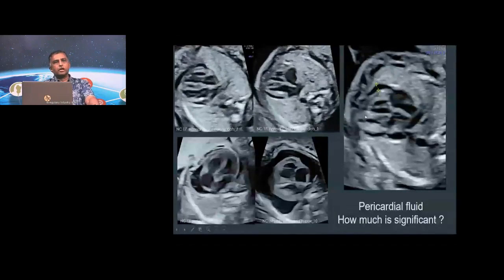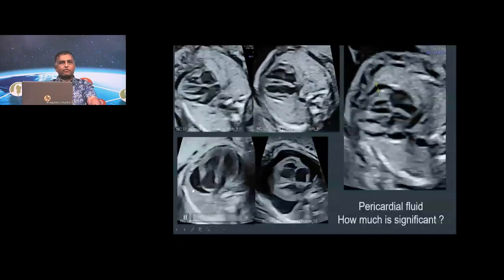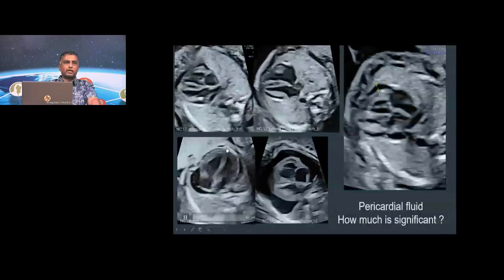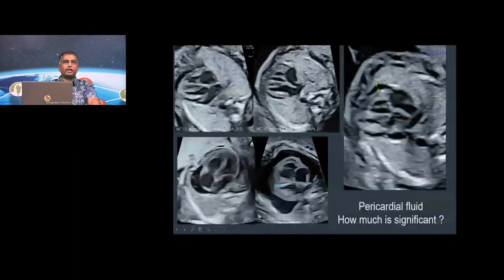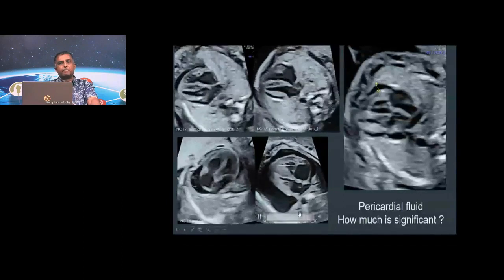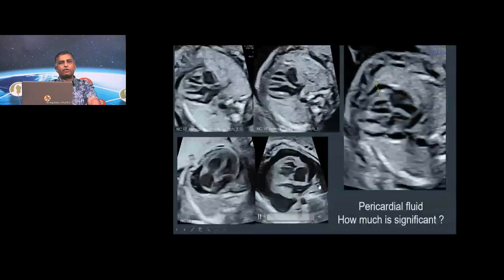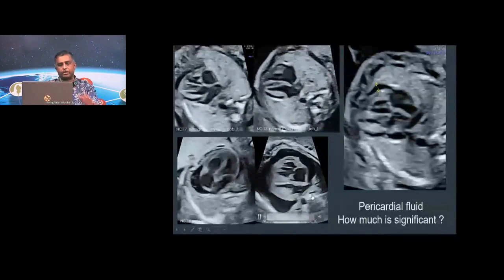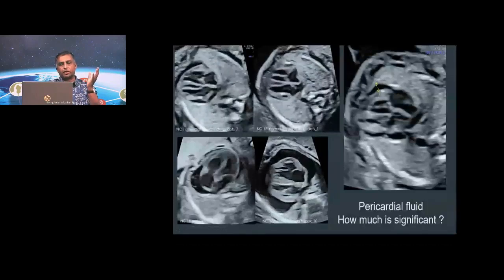is not pericardial effusion. Whereas here, in this particular case, you have some floating echoes in the fluid out there, and also the pericardial effusion definitely is more than 2 millimeters. I would definitely use the word pericardial effusion here, there's no doubt about it. The heart also is enlarged. If you carefully look, the heart is definitely enlarged, the cardiomegaly which has happened there. And in this case, of course, it's a huge pericardial effusion. Those are the lungs which are pushed behind. This is not a pleural effusion because the lungs are pushed backwards posteriorly, and this is the heart, which is a classical rocking kind of a movement that you see, a floating heart in a pericardial effusion, right?